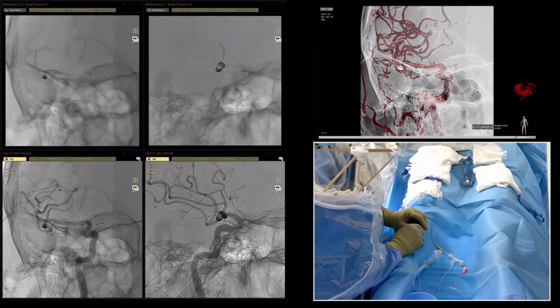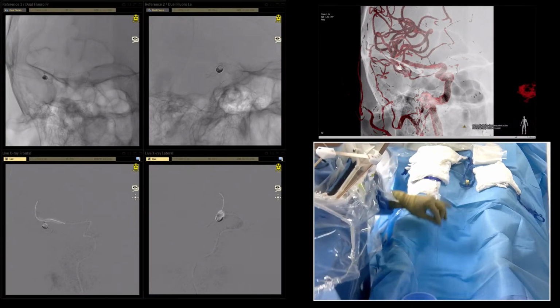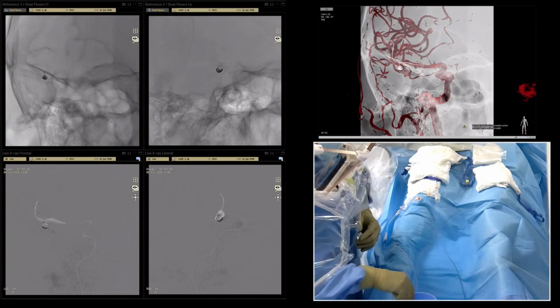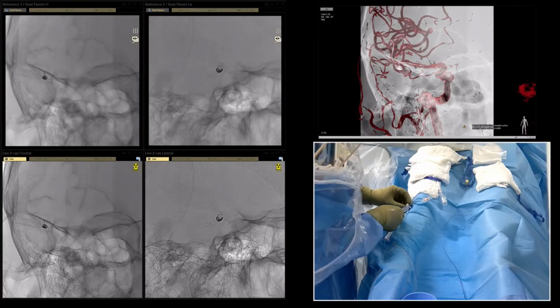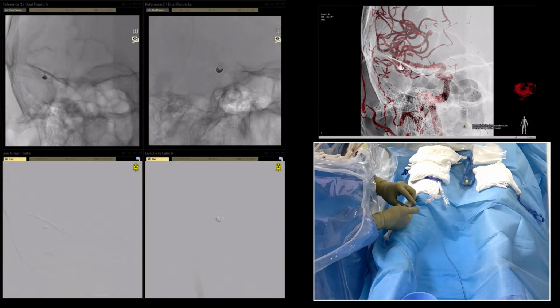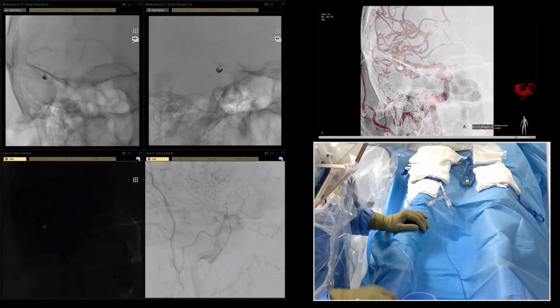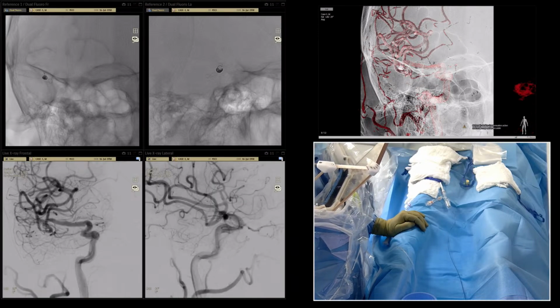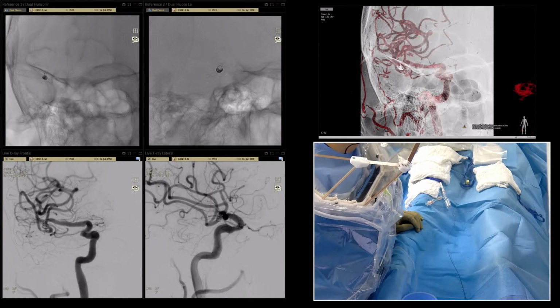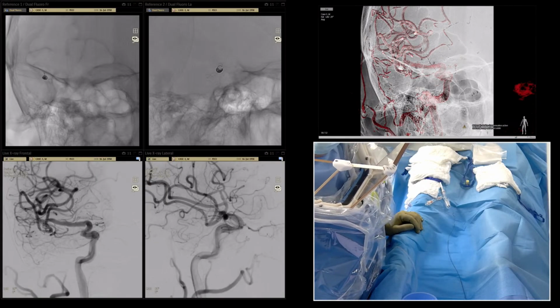The stent is patent. Okay. It's not as open cell design, that's why the braided technology has its own characteristics. Okay. It's 19 minutes from the beginning. We can wait for another 10 minutes to confirm that everything is okay.